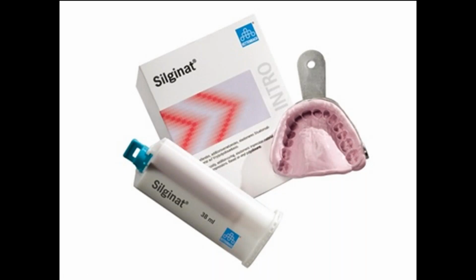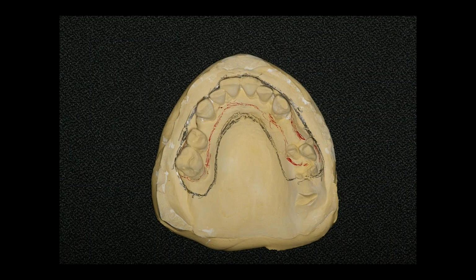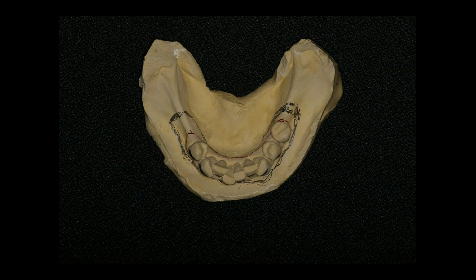When starting with these cases, we'll always start with a diagnostic model. And the nice thing with the Silginat from Kettenbach is that our assistants don't have to pour them up immediately. So essentially you're getting a polyvinyl impression for the cost of alginate. We're identifying the areas for our dental laboratory so they may identify what type of provisional restorations we want to provide for our patients. So here I'm identifying where we'll be leveling and where we will have our provisional restorations extend to. We usually will just extend first molar to first molar.